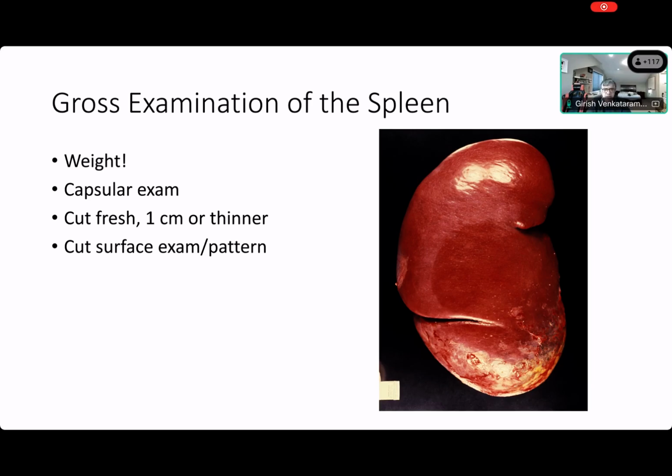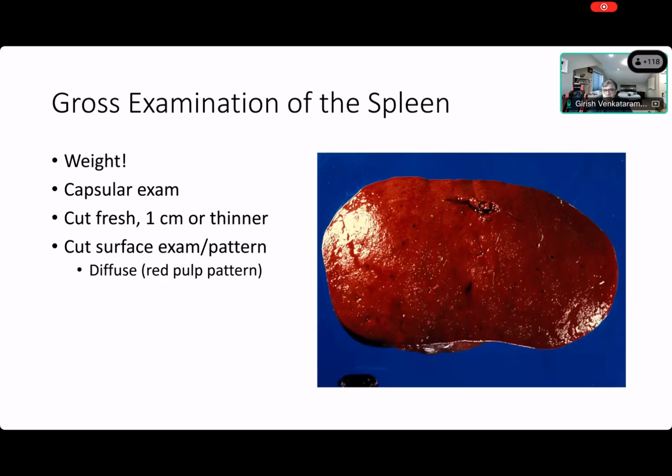Yes, you can have mets, but by the time they do a splenectomy for mets, it will be a very strange situation. They never do it because imaging is so good these days that they don't need to do a splenectomy to identify mets. Diffuse involvement in the red pulp, always take a look. You won't see the white pulp that easily, right? That's important. I presume all of you have read about the histology of the spleen and the anatomy of the white and red pulp, right?